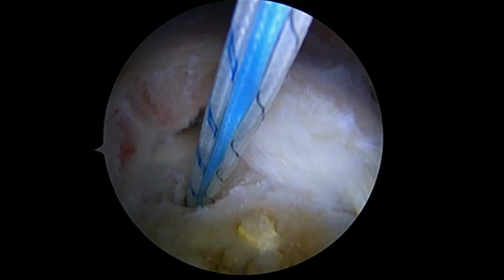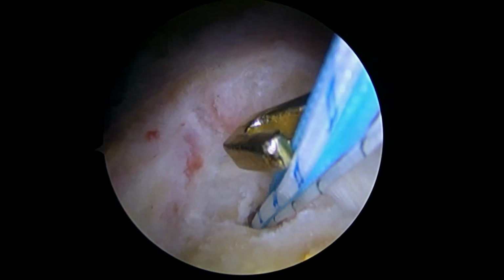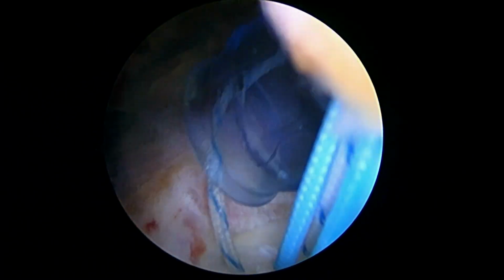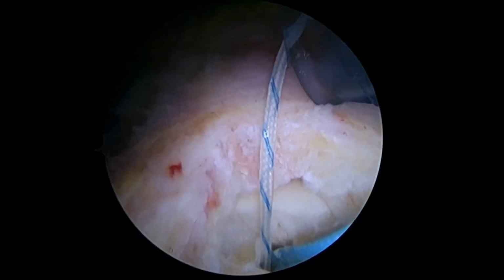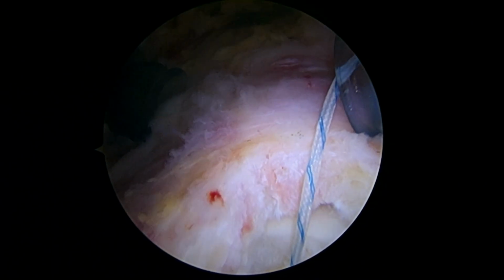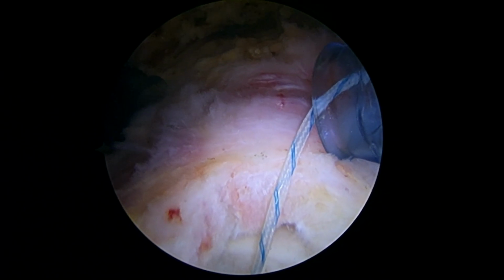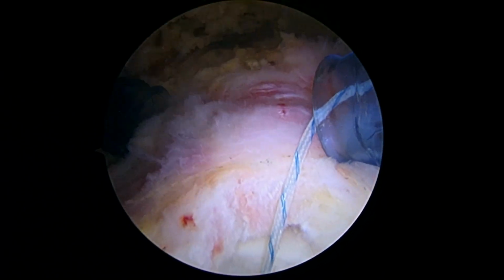Okay, so here's the triple loaded anchor. This is an all suture anchor, which is why we like it. I'm going to reach in and take out this blue and white striped one first. You can see how that sits there. These other sutures we just leave out of the way, and now we're going to place a grasper in the front, so we'll give that to our helper in the front.